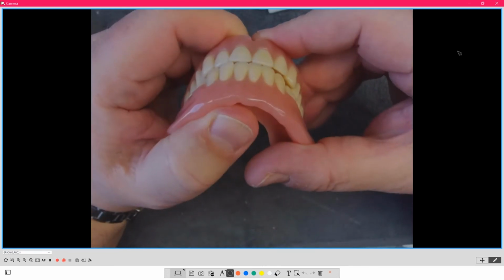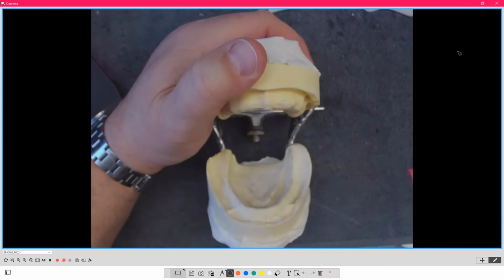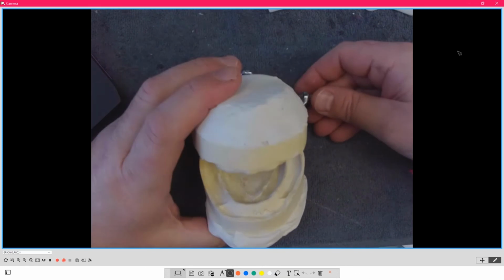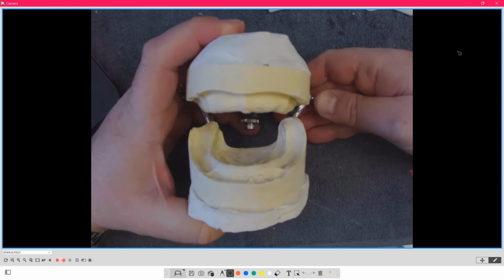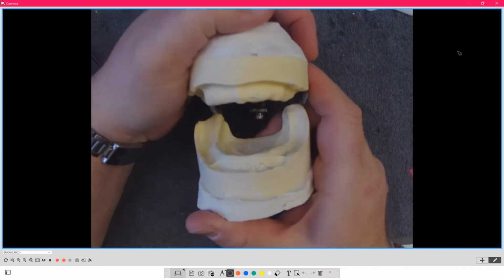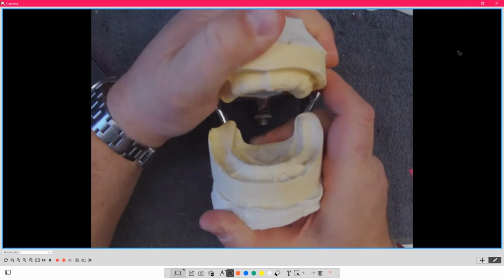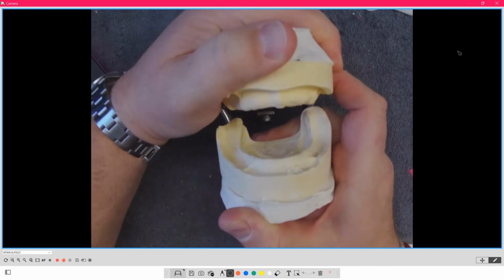So that's what we're taught. This is our standard, okay? And again, I'm just going to switch to this really quickly. So if you are in an office that uses this type of articulator, again, we're used to doing this. So we are checking working and balancing contacts by doing this. So in all those videos I showed you, does this represent anything like what you just saw? No. I want you to take this now and hold it in your hand, and you do this to it. It's going to take you a little bit to figure it out, but even this articulator, you can do a chew cycle. I can mimic a chew cycle on this thing.